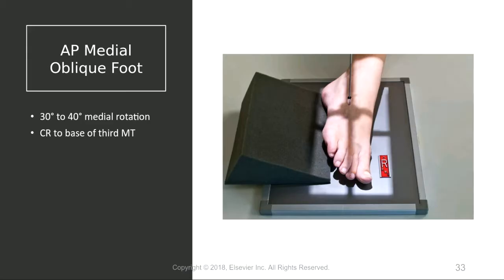Next, we do an oblique foot. Okay, that is on page 233. And this is typically a 30 to 40 degree medial oblique.